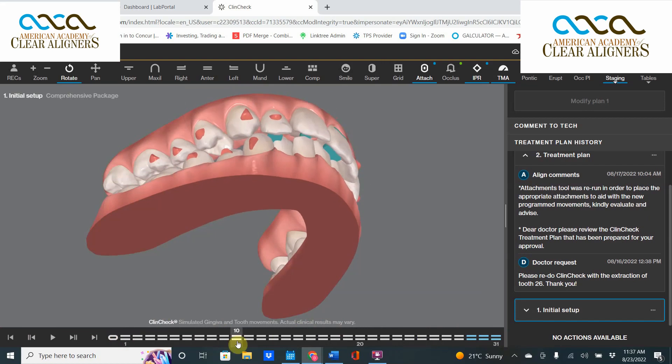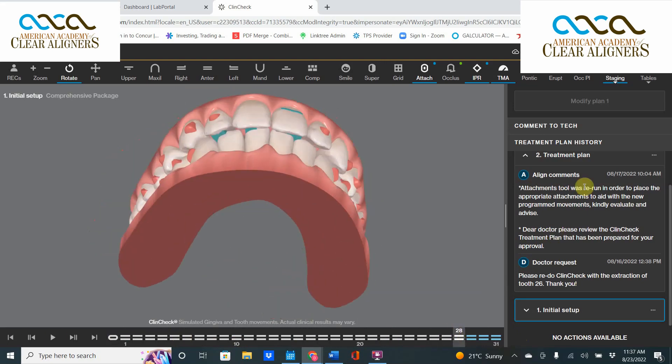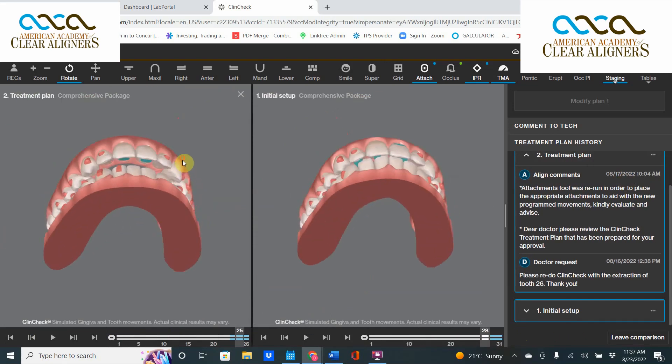So instead, in this case, we're going to have to go back and revert to the plan where we leave that tooth in. Even though she's going to be on quite a track to get to the right spot, you can see that the end-stage overjet in this case is going to be much, much better.